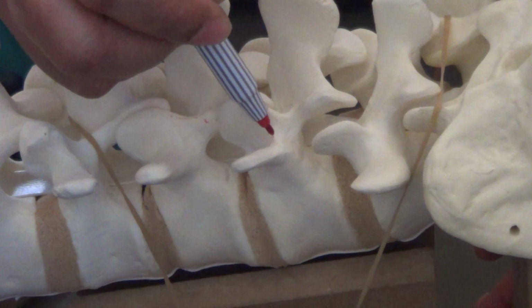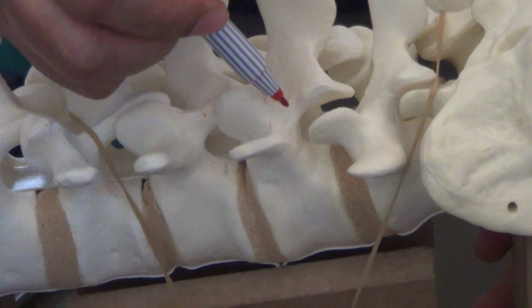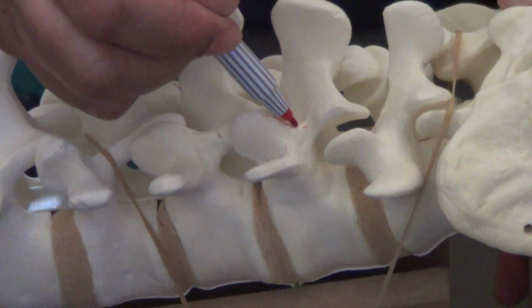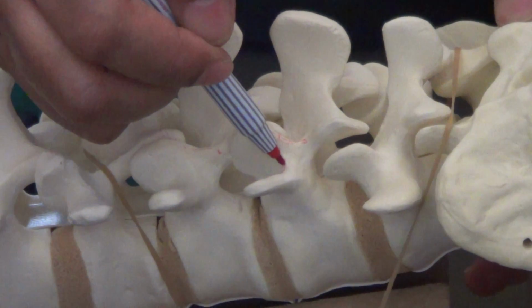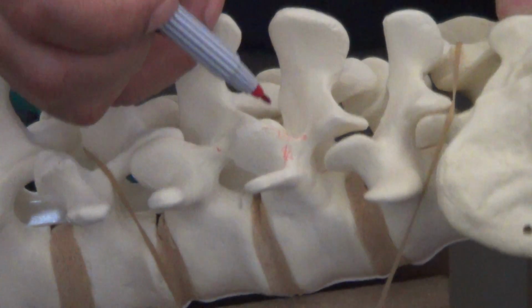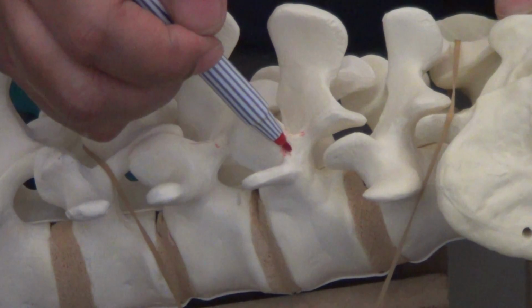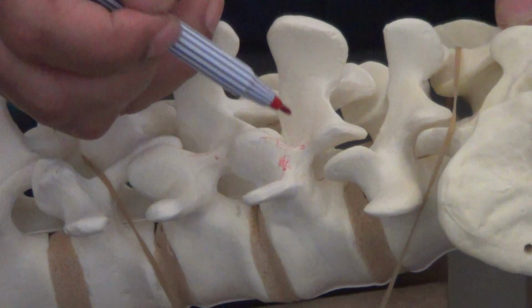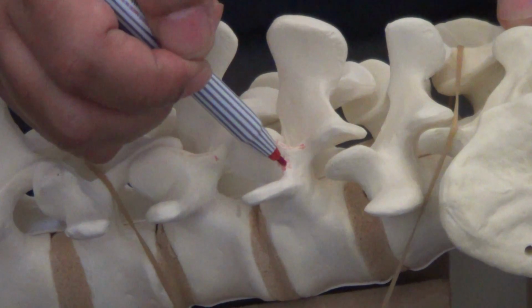The other entry point which most of the people use is, you see there are ridges here. There's a ridge of the extension of the lateral facet there, and then there's a ridge in the midline which comes here. Where these three ridges join is the entry point. If you look carefully, there's a small bump there which is called the mammillary process. So that is the entry point. Right? Most of the people use the mammillary process as the entry point.